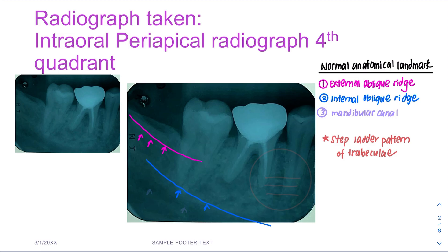We can appreciate the mandibular canal here — the radiolucent line. We can also appreciate the step ladder pattern here. This is a trabecular plate that is arranged in a horizontal manner.